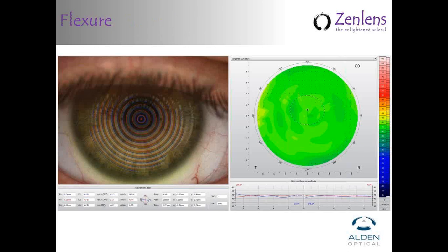If there's no flexure, and I think this would be an example of a situation, if there's no lens flexure, you do topography here, and you can see there's no obvious bow tie or signs of cylinder running through here. This would be a case where it's probably lenticular cylinder, and we would do a front toric design, which is simply stabilized by the dual thin zone, dual elliptical stabilization system, and that's been working quite well. It basically becomes essentially the same as fitting a toric lens in that case.